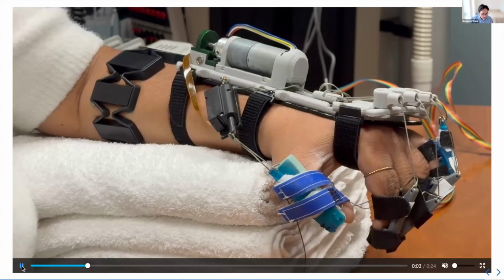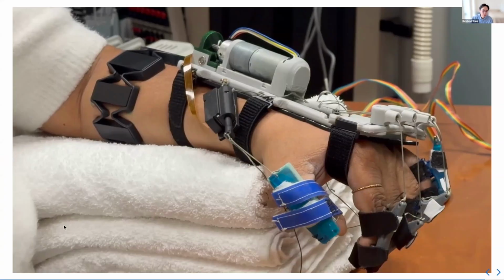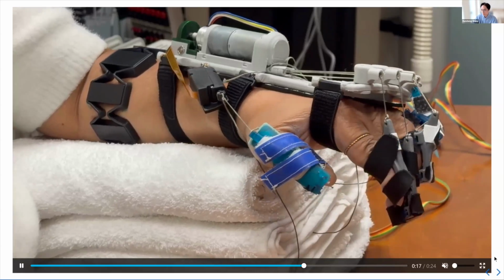And if I continue playing this, you will see that the orthosis gets engaged and the person opens. It helps the person to open her hand. And I think we have one more repetition here in the video. Let that play.